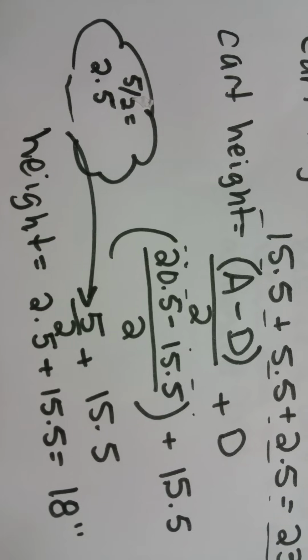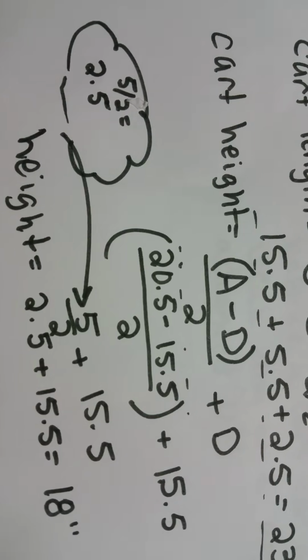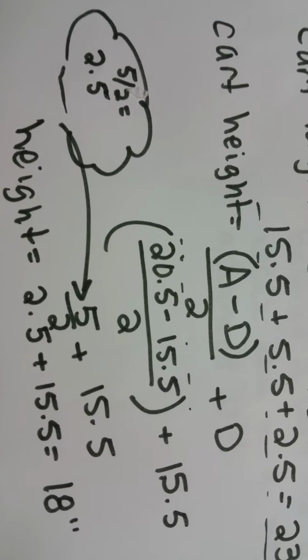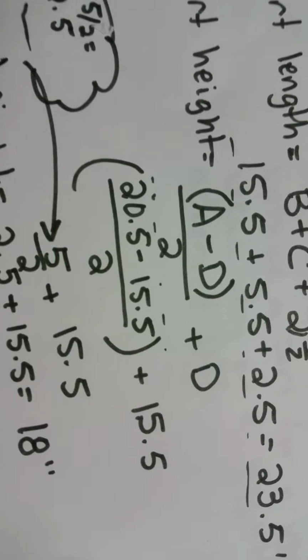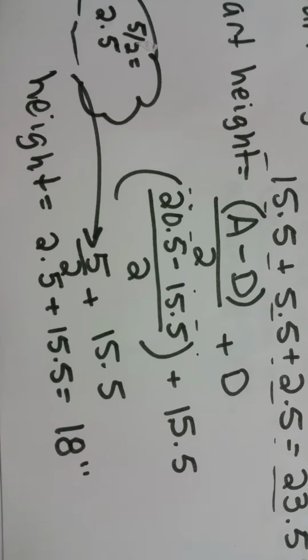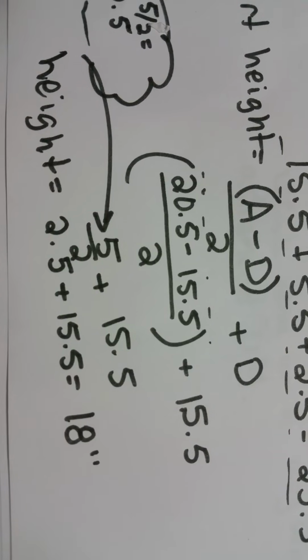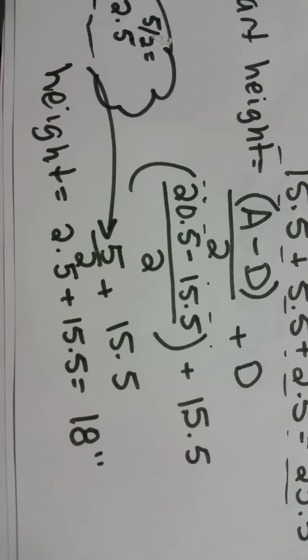So here we have 20.5 minus 15.5, which gives us 5. And then we're dividing 5 by 2, which is 2.5. Then we add that back on to D, or you could subtract it from A, but it's easier to add on to D. And we end up with 2.5 plus 15.5, and we get 18 inches for this cart total height.